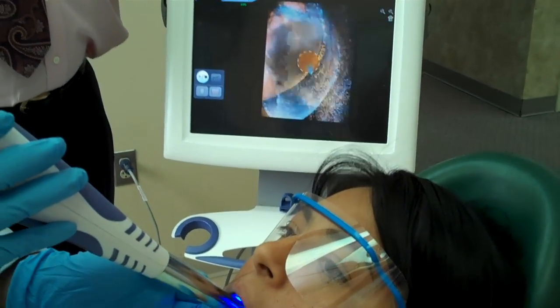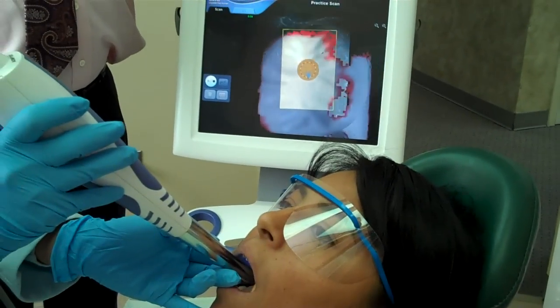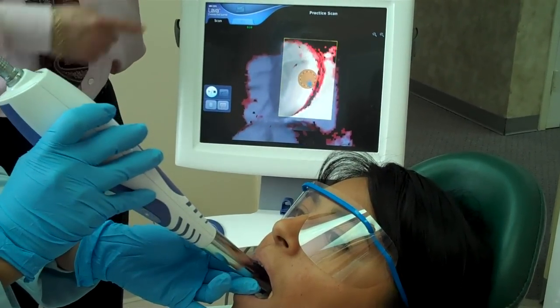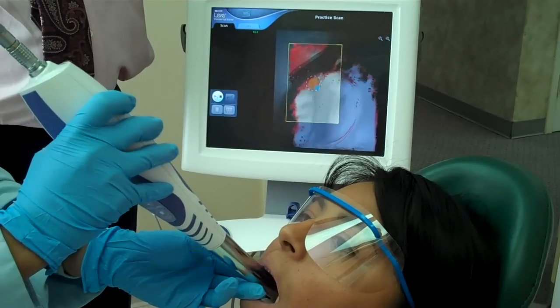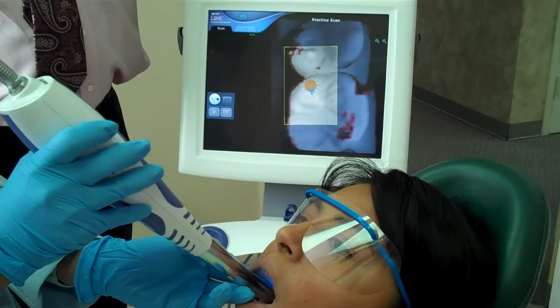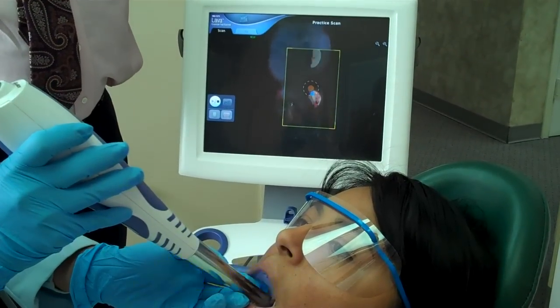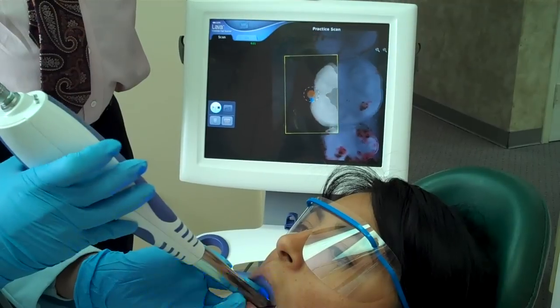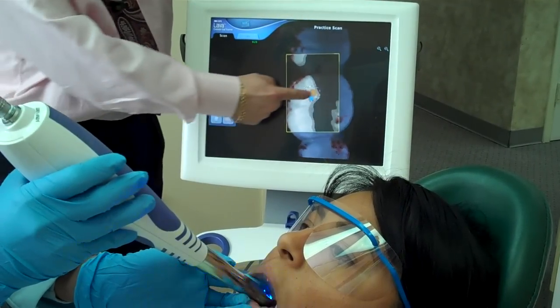It doesn't have to touch the patient's tooth. There's nothing that tastes bad. There's no gagging involved with this type of impression. And up on the video screen, you can see that all the areas that are turning white are the images that are being picked up by the computer. As we scan this tooth, the computer lets the assistant know when she's in the right position with this little yellow dial right here.